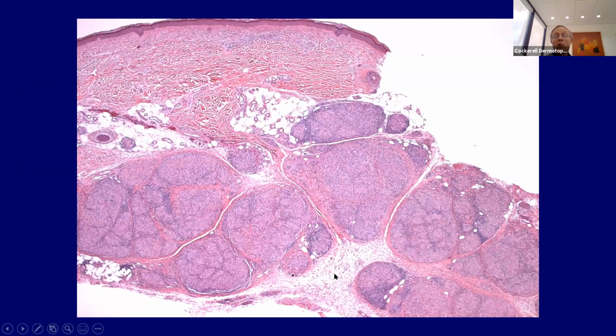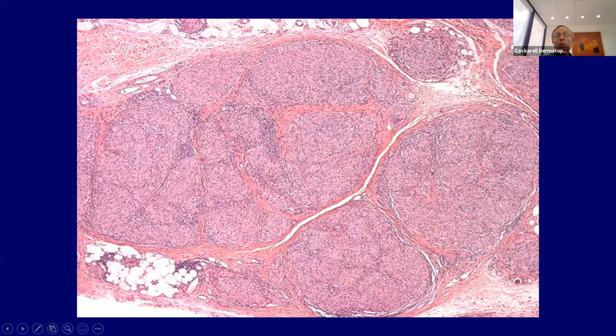So this is a form of lobular panniculitis with granulomatous inflammation, and these are all sarcoidal granulomas with limited amounts of lymphocytic infiltrate. So the differential diagnosis here might include another sarcoidal granulomatous process related, say, to a foreign body, like a metal like beryllium or zirconium. But when you get this massive amount of sarcoid involving the subcutaneous fat like this, it's pretty classic. This would probably be considered the Darier-Roussy type. It might fit with that clinical appearance, but from a histologic appearance, we would really just say this is sarcoidal panniculitis and would favor true sarcoidosis here.